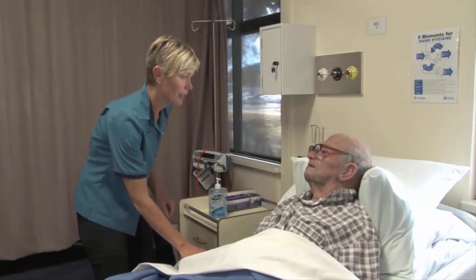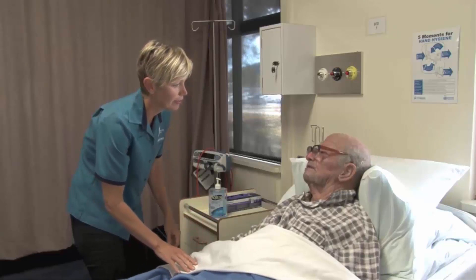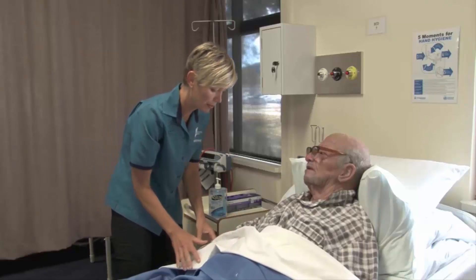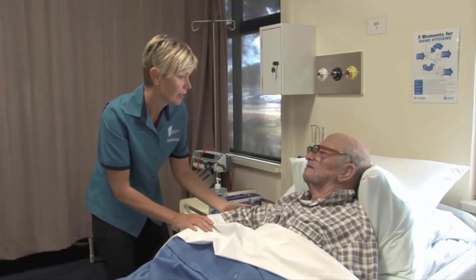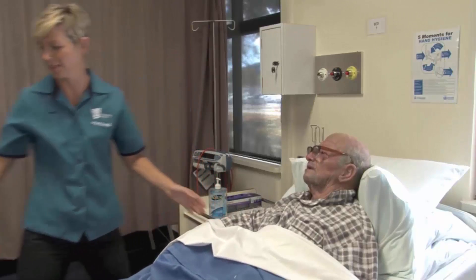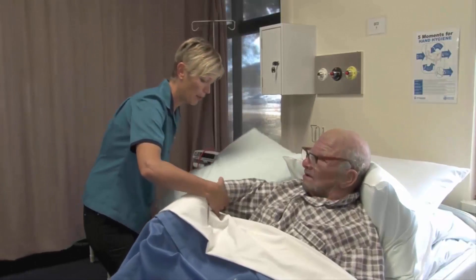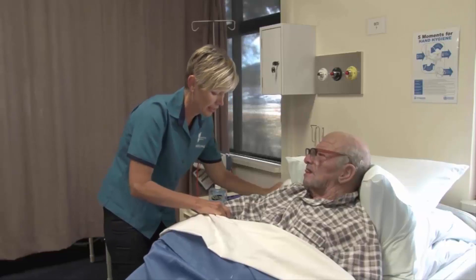All right Stanley, do you mind if I take your blood pressure now? Would that be okay? That's fine, yes. I'll keep my fingers and hands under my blankets — I'm a bit chilly. No problem. What I might do is get another pillow, because I need to put it under your arm so that it must be at heart level. Just got one here. I'll gently pop that under there. You okay? Yes, that's marvelous, thank you.